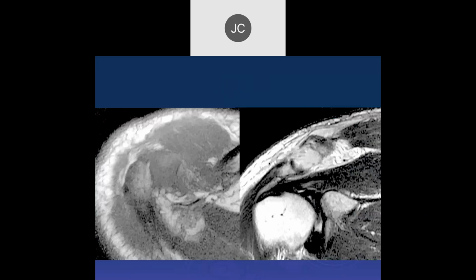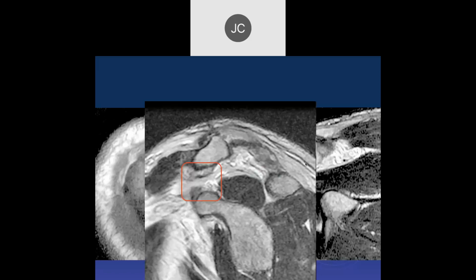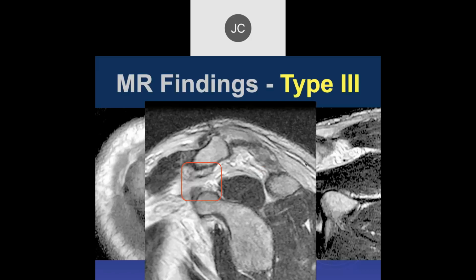Okay, so here, yeah, there's widening of the AC joint on the right image. For type 3, if I saw this, I would be concerned about a possible type 5. You have to skip past 4. So what's the next thing you want to look at? The coracoclavicular ligaments. Yes, and those look torn. Both the conoid and the trapezoid components of it are torn through here. On the sagittal images, you can see the tear there. Yes. There wasn't a lot of displacement on physical examination, so this was thought to be a type 3.